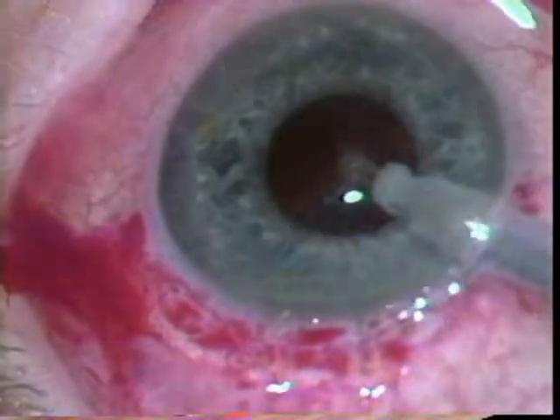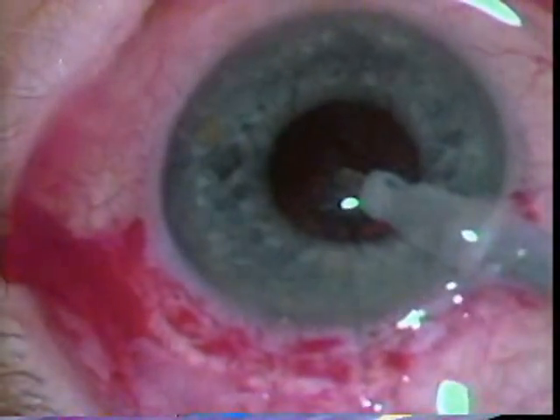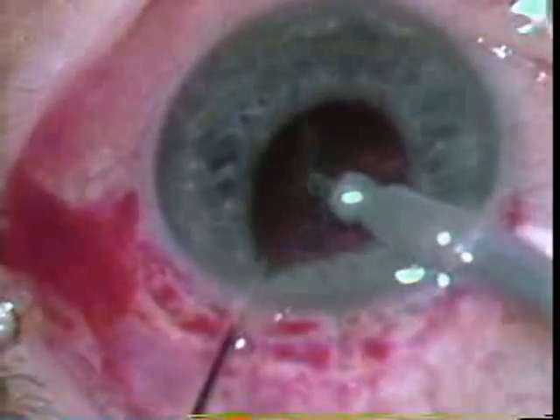It's tricky to do the cortical material with the extracap because you don't have a nicely defined anterior capsular edge — you have a bunch of little tags left over when you do the can opener.